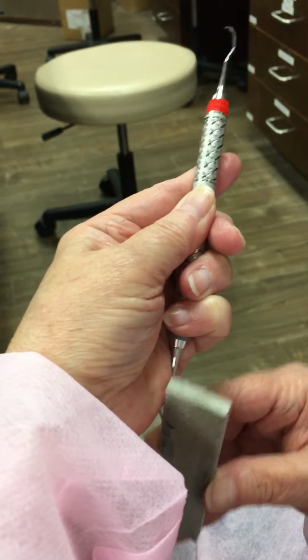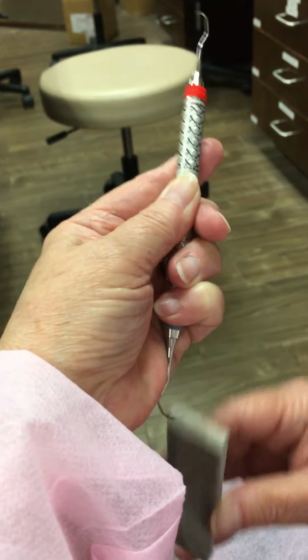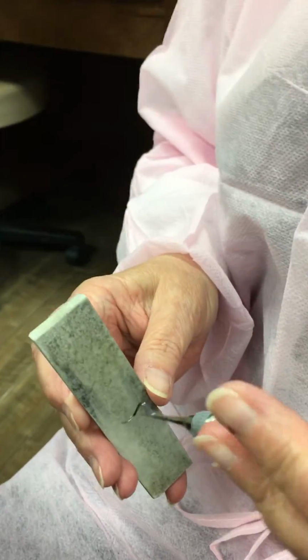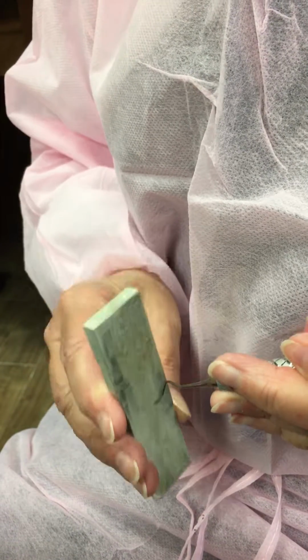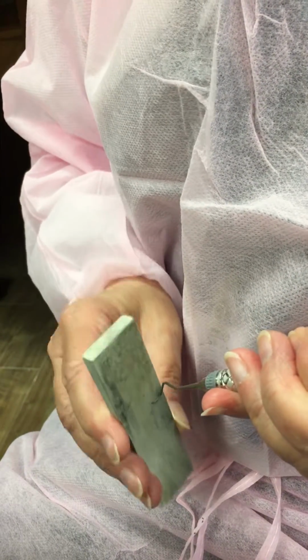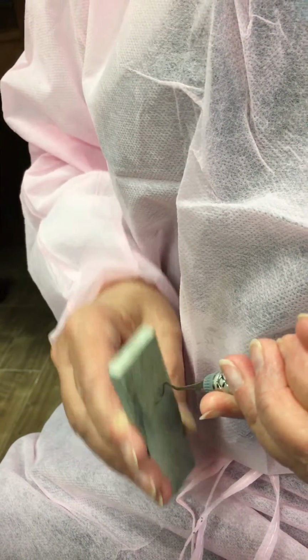Starting at the back, 90, 110, finishing with the down, and I have sludge. So now I'm going to turn my toe in the opposite direction, and I'm going to bend my handle away from me so that my lower third of the shank is perpendicular to the floor, parallel to my stone. 110. So I've moved from the back to the terminal third. Now I'm going to flip it and do the other side.